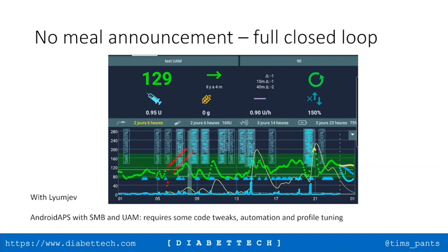But you're right, Mexican food and Chinese food is really tricky, and you have to help the system to cope with it. Chinese, I have to bolus quite a bit early on if I want to not end up going up to a level of around 180 to 200 and then staying there. That's the only way I can do Chinese food. Yes, but I think this no bolus thing is really amazing, how APS can deal with it. I'm really impressed.